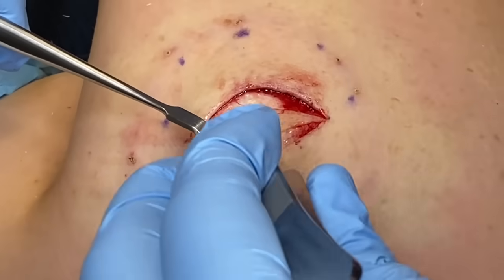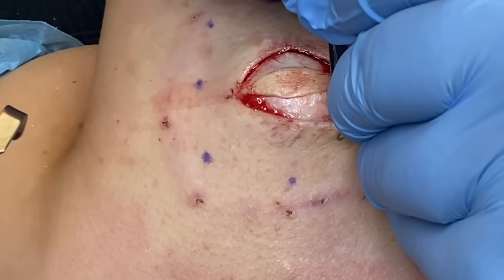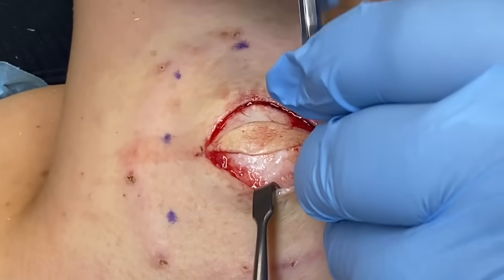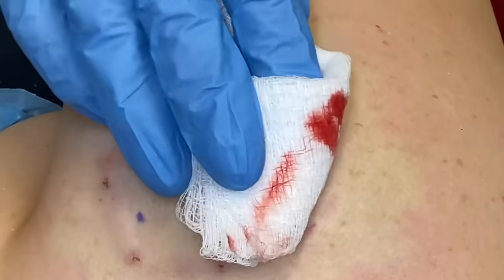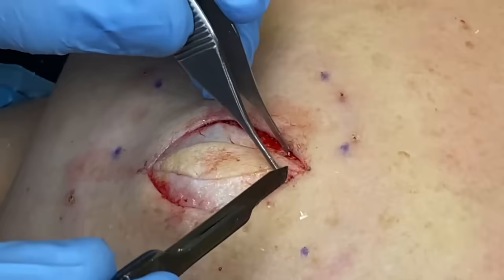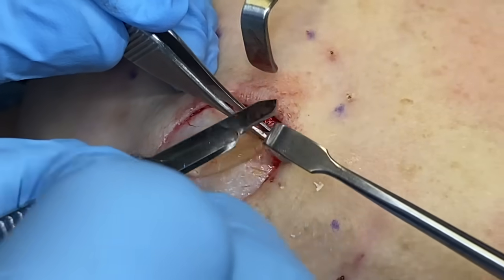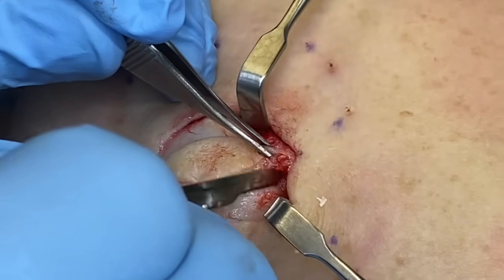Yeah, this is actually pretty taut. So I'm going to come back around to your side and I'll dissect this side out. Same thing here. So at the edge, I'm just going to dissect around that. So I just swing the blade.